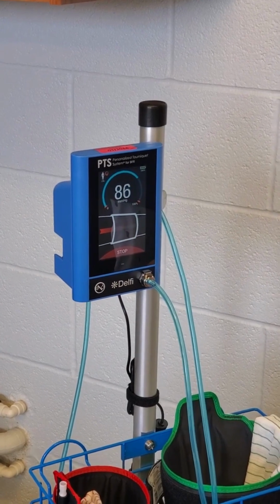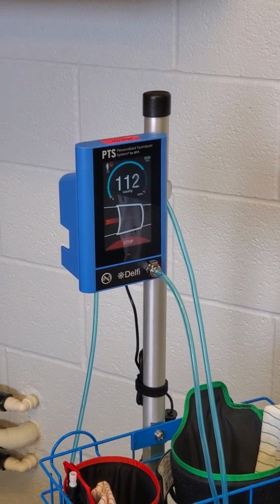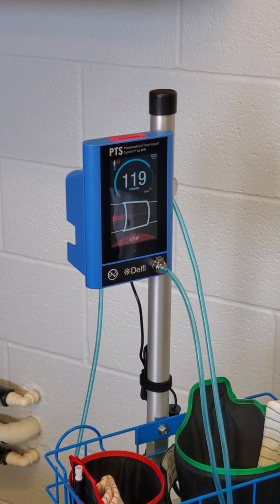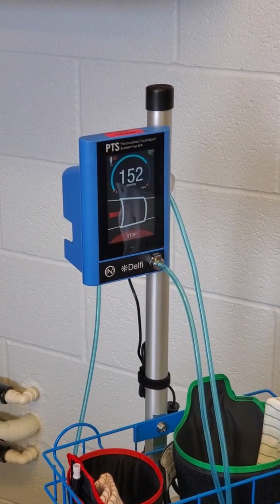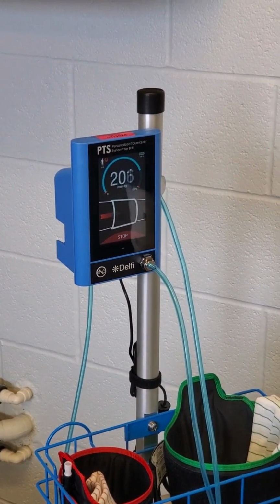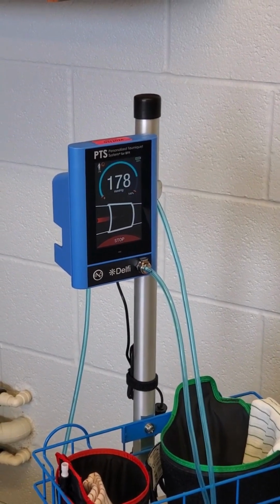It's similar to a blood pressure cuff, and it's occluding 100%. You can't talk. It's going to go until it stops. Yeah, full occlusion. Can't listen either. She's got a nice strong slow beat.